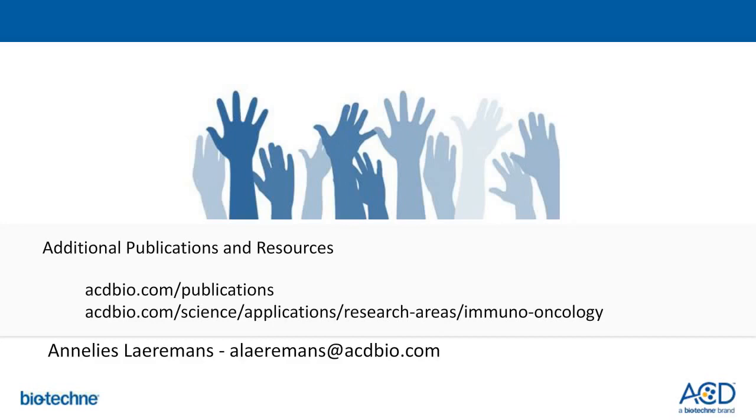Is the new V2 fluorescent assay different from your existing RNAscope V1 fluorescent multiplex assay? Our V1 assay is primarily for fresh frozen tissue. It is also a shorter assay and contains all the necessary components to run the entire assay. Recently, we also launched the V2 version of the fluorescent assay, and this assay is TSA-based. This assay is slightly longer, but it is optimized primarily for FFPE tissues.